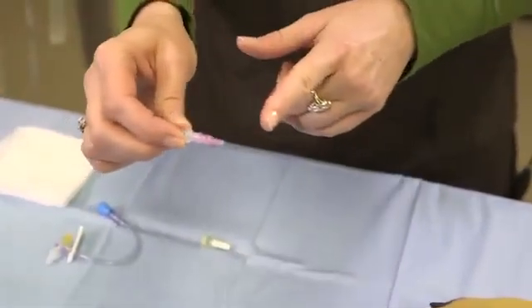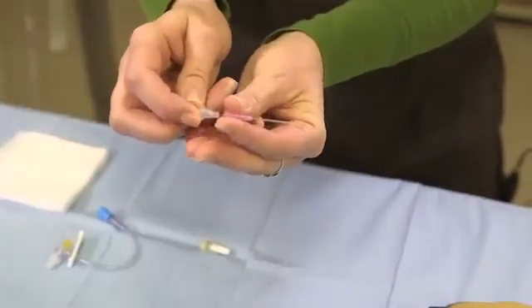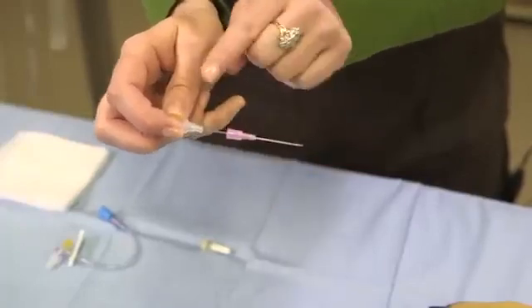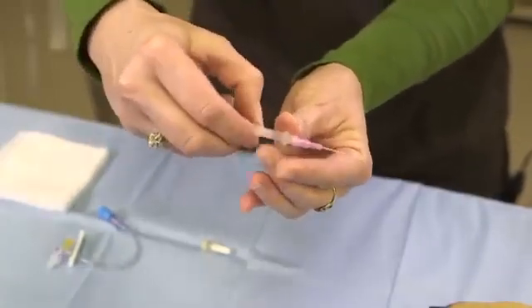This part right here is the catheter. This is what slides off the stylet. This portion is the stylet. Then you have your cap.